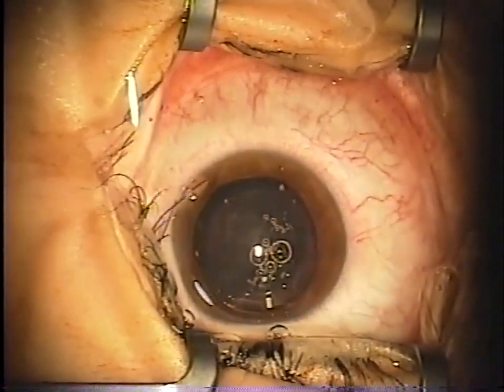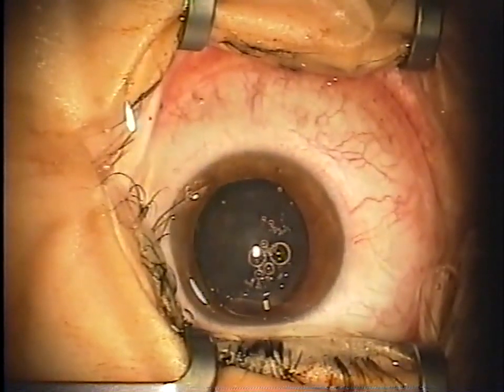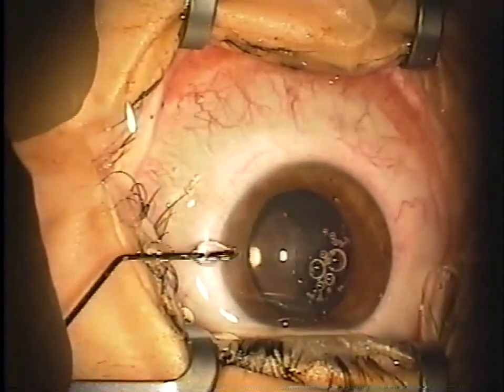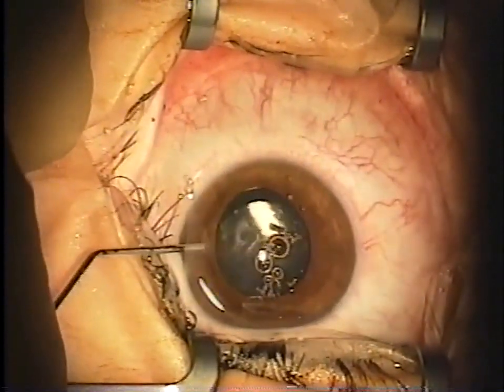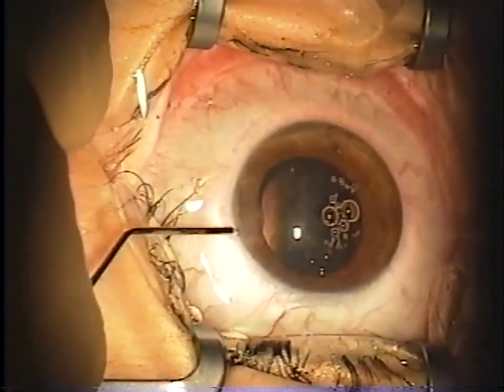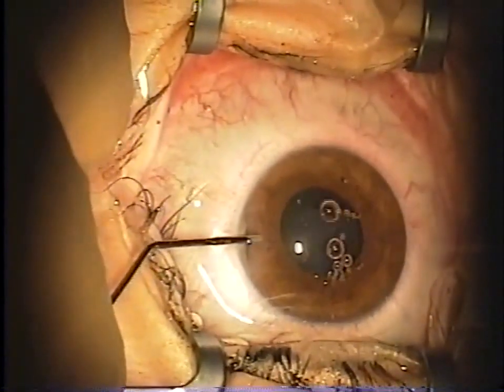This procedure is very nice in the fact that it is completely reversible. You can take the lens out if there were any complications, which are very rare. It also does not mess with the patient's corneal topography, so later on when they're going to go and get their cataracts removed later on in life, there's no problems with their calculations, and you can be very accurate in getting them right on the money for distance vision.